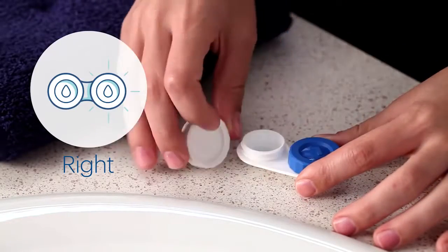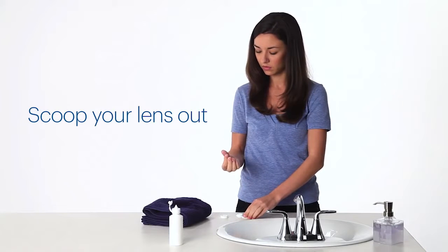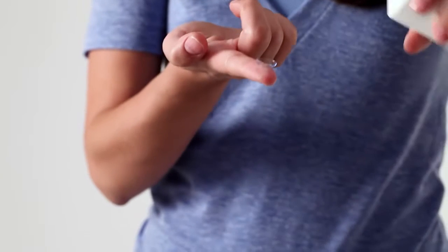Always start with the lens for your right eye so you don't mix them up, since each eye has its own prescription. Scoop your lens out of the case, then follow the instructions for your lens solution.